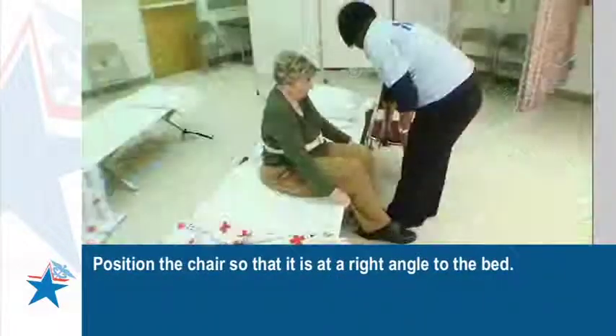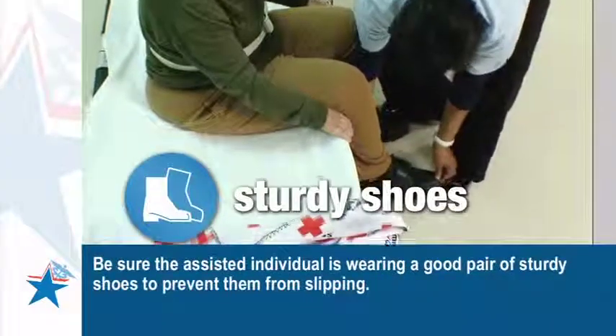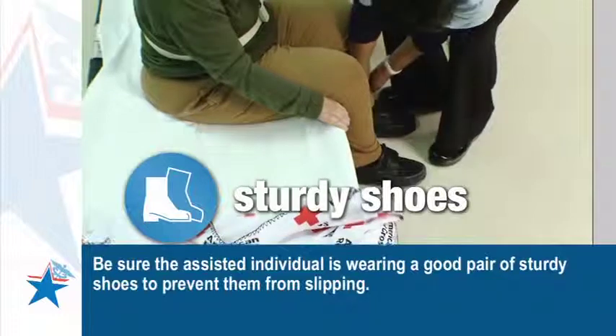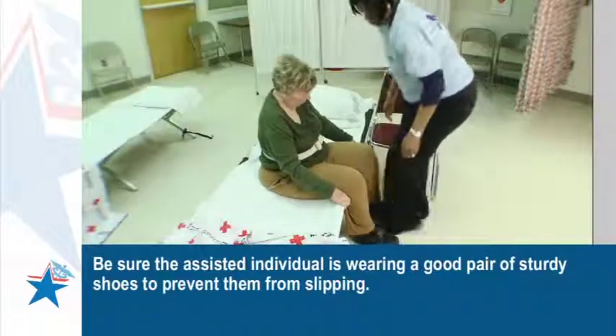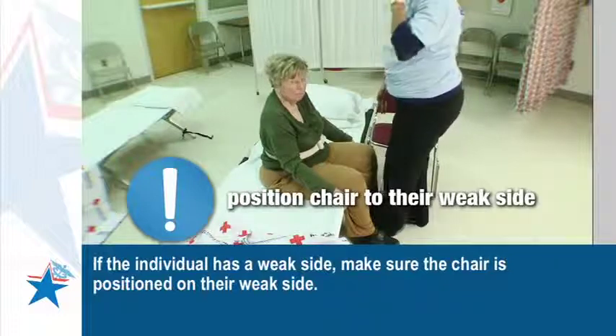Position the chair so that it's at a right angle to the bed. Be sure the assisted individual is wearing a good pair of sturdy shoes to prevent them from slipping. If the individual has a weak side, make sure the chair is positioned on their weak side.